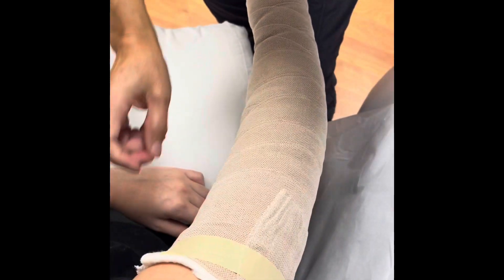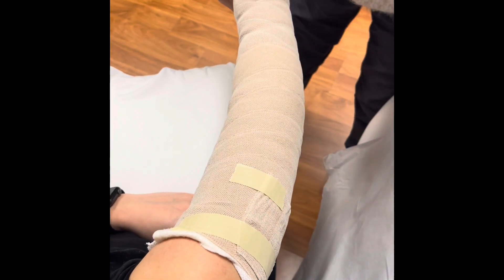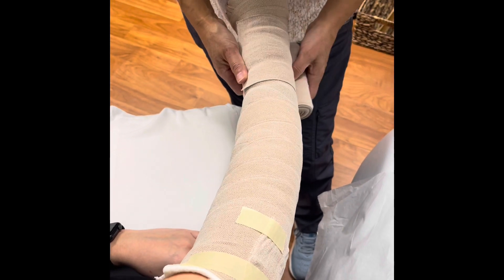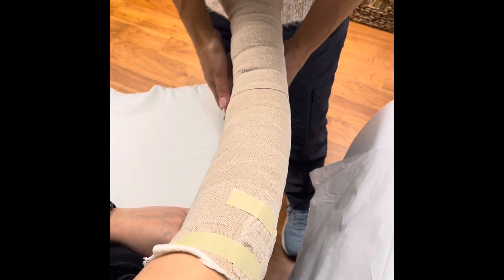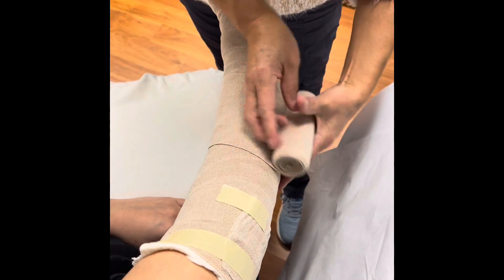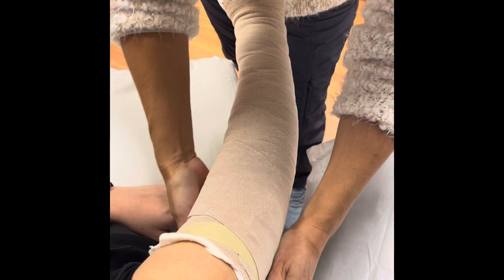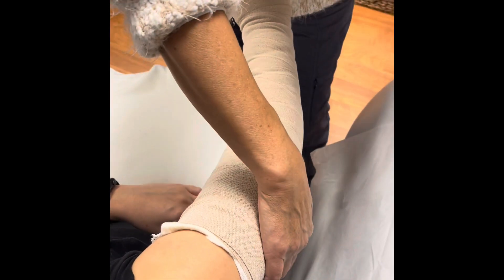We can leave it like this, or we can cover the entire thing. If there was more fibrosis to worry about and you were concerned with shifting or loosening of bandages, you can cover it with a wider one that goes all the way from the wrist up — almost just as a cover, not creating a lot of tension. Then at the wrist, we tape it.